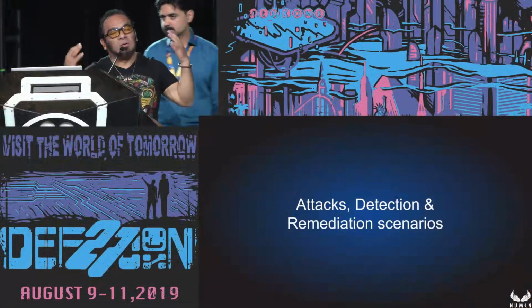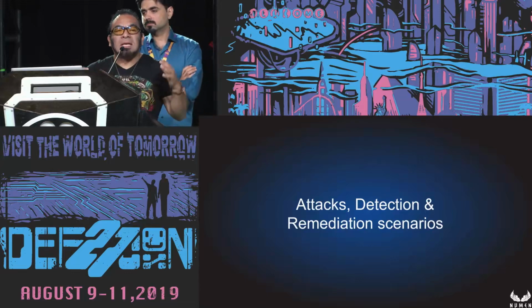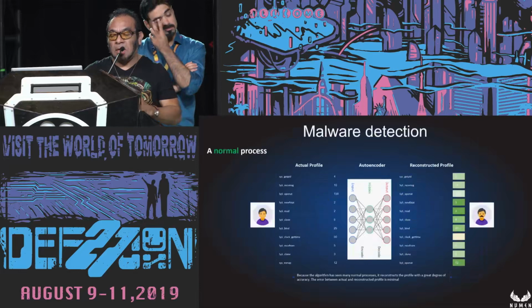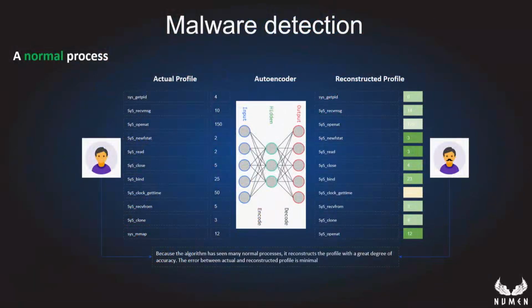Okay, guys, so let's get to the fun part, because after this whole effort, as you can see, now we know the basics. We know how to use VMI to introspect into the machine. Now we are able to have the board, everything, right? Now let's see what we can do from an attacks perspective and detection with these components in the board. So the first approach is a typical malware coming into a car, into a medical device. How can we tackle that problem from VMI?